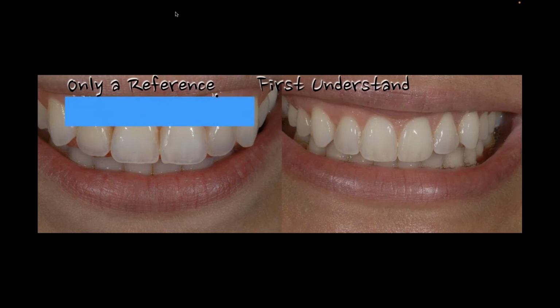The middle third of the tooth is where the value has to raise. And if we raise the value properly, then that cervical third should have a little lower in value or a little bit more chroma or more light absorption. I think it's really important that we really break those two definitions down. Without that, you get a very monochromatic looking and a very fake looking tooth. If your patient wants fake, fine, make it all in one white bright shade. But if they want them to look bright and real and natural, you need to vary those colorations.